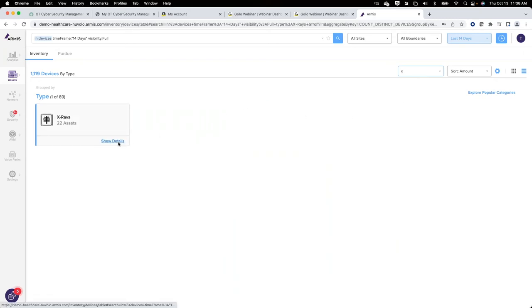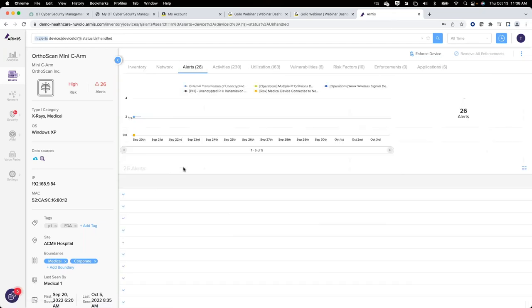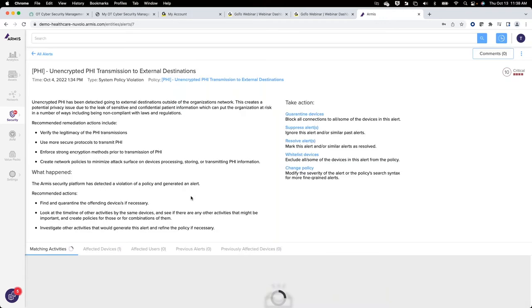I can just show you exactly what he means by that by going back to that threat, and then I'm going to pass it on over to Dustin because he needs to do his thing, right? So let's just say this alert specifically is what you're talking about. Yeah. Armis alerted on that. You can come over here and whitelist that device that's coming in. You can change the policy to not alert you on it. You can suppress that alert to say that you're accepting it, and you can even go in there and determine why you're suppressing it. Whether it's an accepted risk, whether it's something that we don't need to be bothered by it. So you just get to determine why you're suppressing it as well. And it actually will show up there to why that is. So if somebody else is doing it, it's not you, you can go back and review and see why that alert was suppressed.